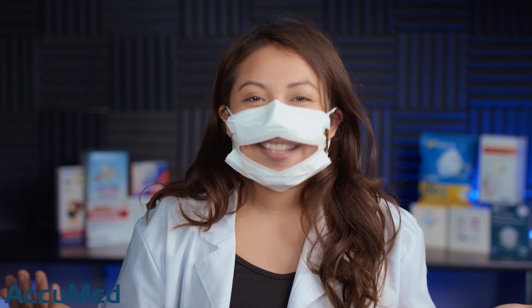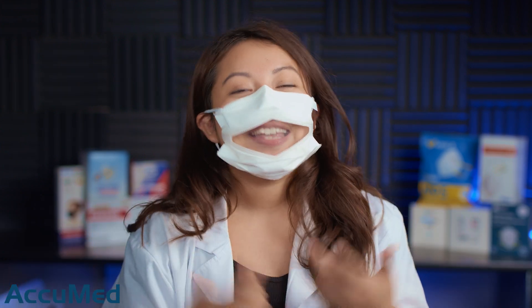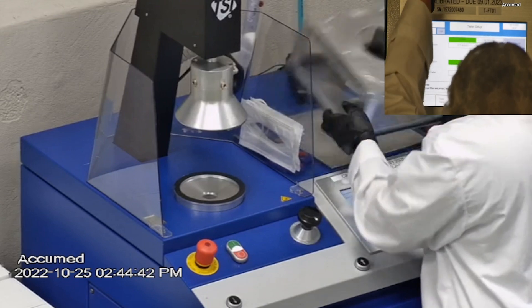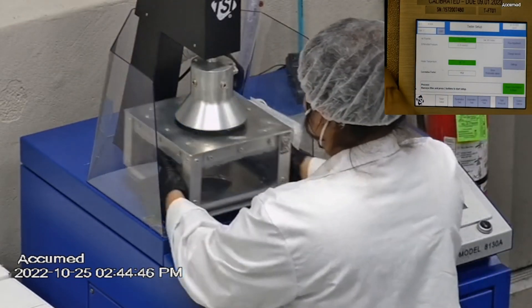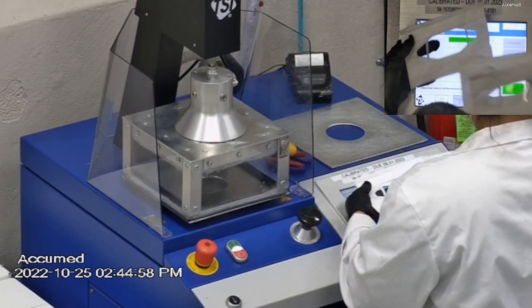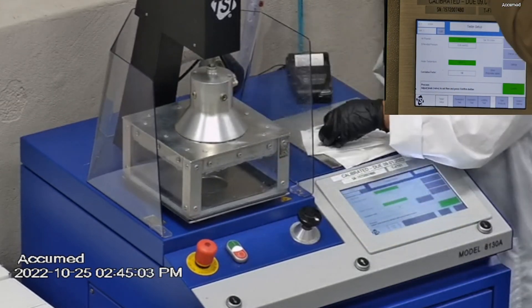With that being said, I'm not even going to take this off because you guys can read my lips, but let's go ahead and see how these test on our TSI machine. We're going to be testing both the filtration efficiency percentage and the pressure drop. This is our TSI machine model 8130A.